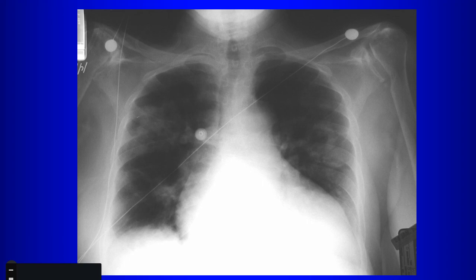So if you suspect that, what clinical question might you ask the referring physician? We know the patient has rheumatoid, but in most cases, they have longstanding rheumatoid, right? But one other thing that about 90% of these patients also have is what? Hand pain? Well, it's from the rheumatoid. We know they have rheumatoid. It's a given. What else would you look for? What else might you ask the clinician? These are necrobiotic nodules in the lungs, right? So what else might you ask the physician? Are they immunocompromised? Well, where else do they get necrobiotic nodules?